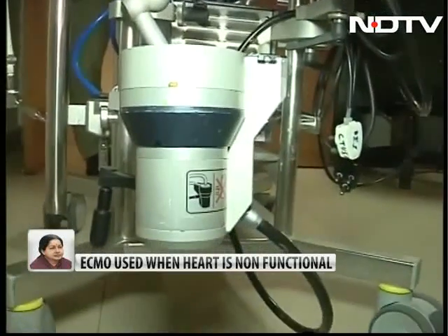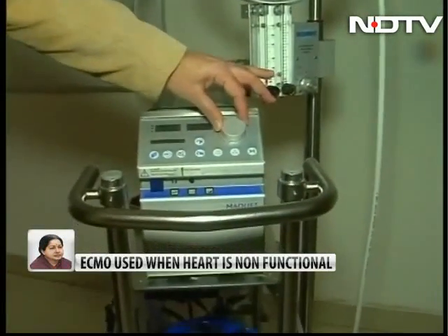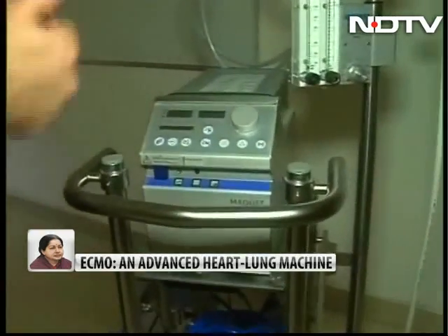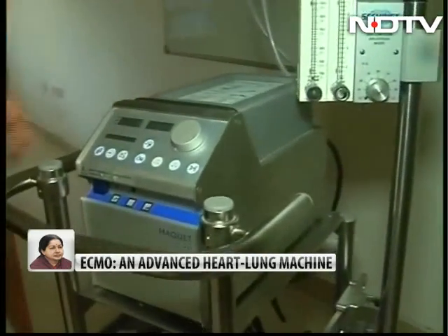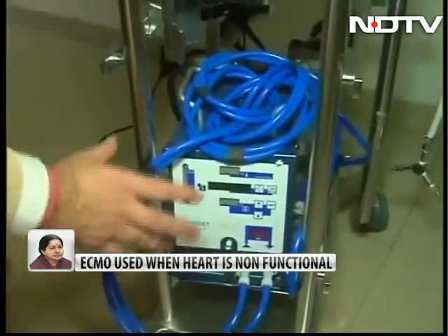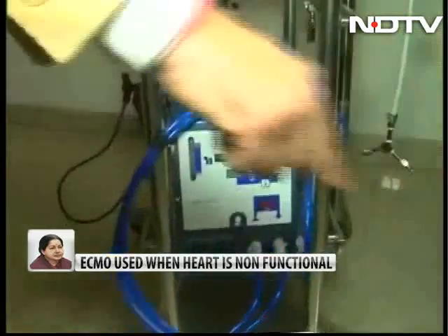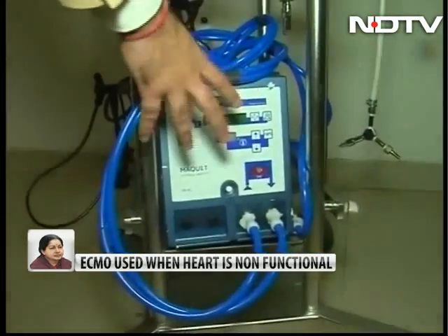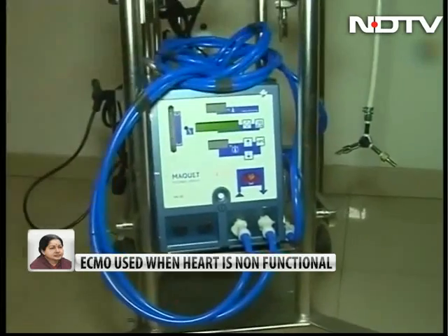So this is a controller. As you can see the numbers here, this determines how much blood is flowing from the patient to the system. This is a temperature controller. Because the blood is flowing out of the body, the temperature needs to be maintained, and this machine does the job of maintaining the adequate temperature of the patient.